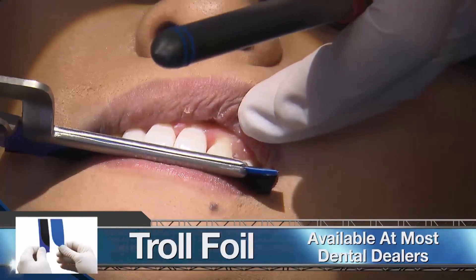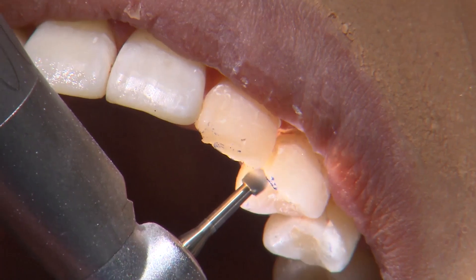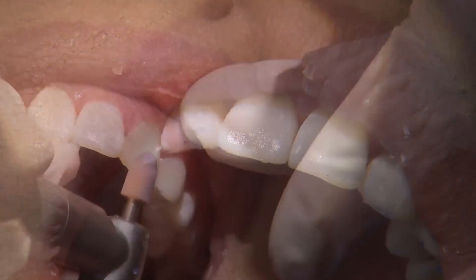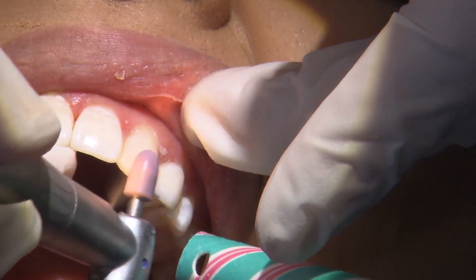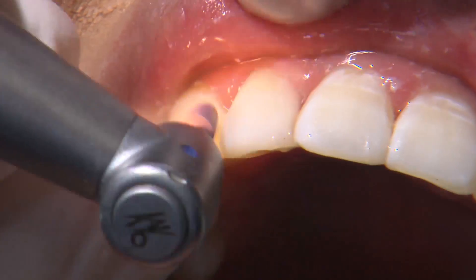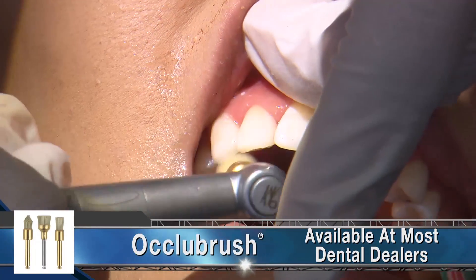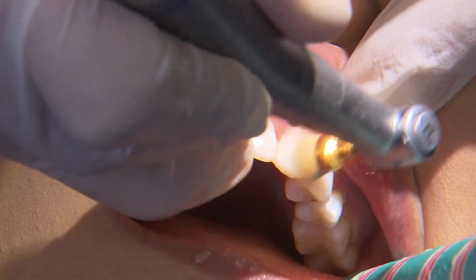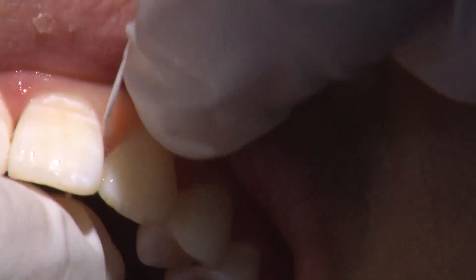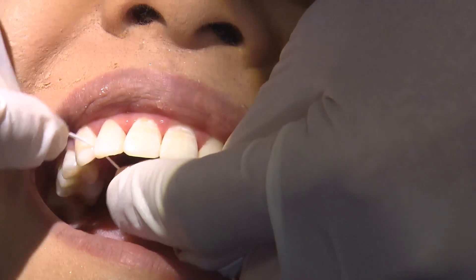Here I go ahead and check the occlusion, and in this case I do like to use a slow-speed round bur to adjust any high spots — it typically will remove the composite material with minimal effect on the enamel. I finished the restoration with a coarse composite polisher and then a fine composite polisher just to remove any surface scratches, and then I finalize the polishing using an Occlu-Brush by Kerr. They have special impregnated fibers that polish the composite material to a high shine without the need for an additional paste. Once everything's completed I check the restorations with floss and ensure that they run smoothly and there aren't any rough areas along the transition to the natural tooth.